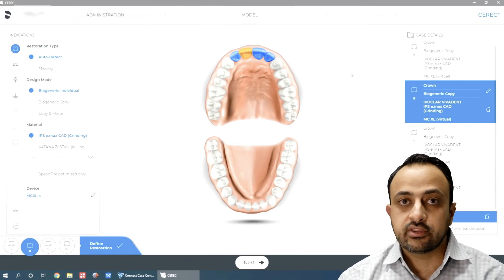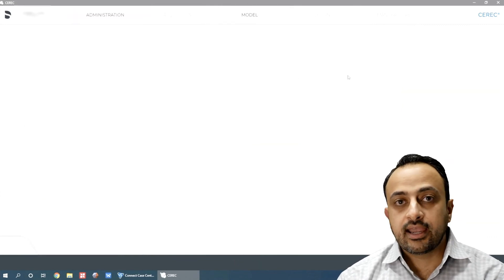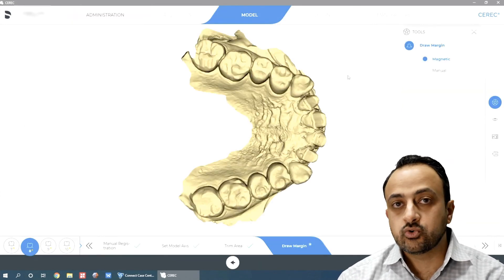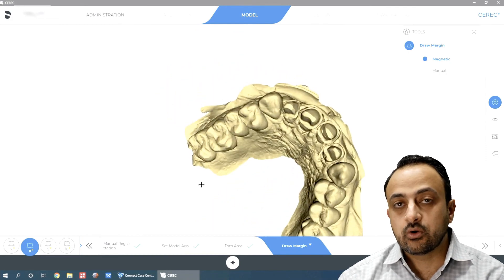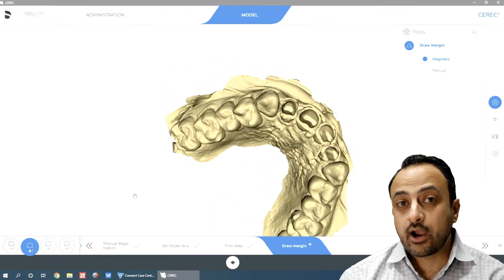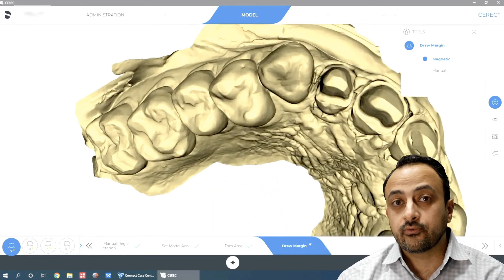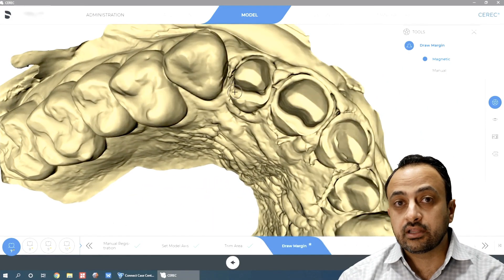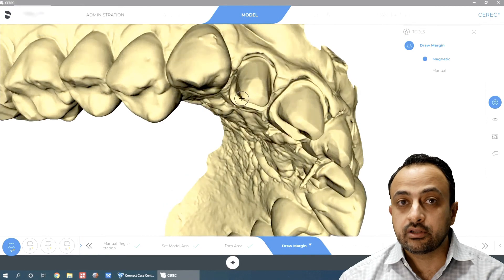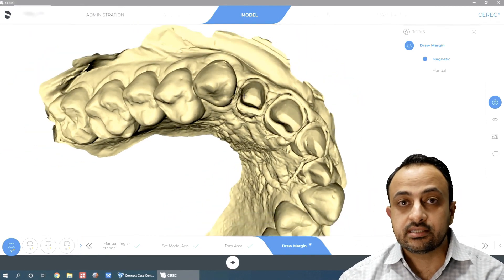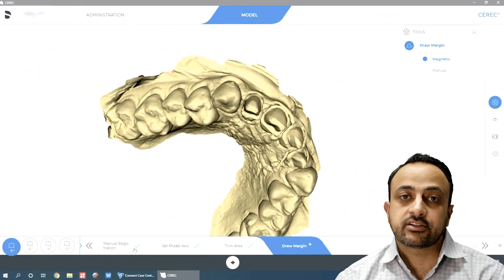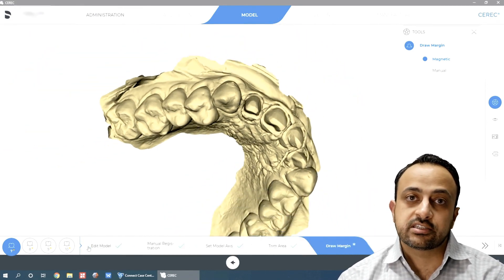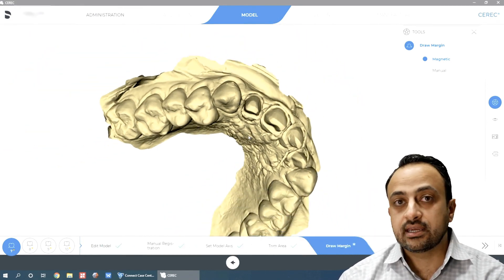Once I get everything designed, I can proceed as usual, send it to my milling machine and finish the case. So again, one of the most powerful features of the InLab software is the ability to import STL files and then send them back to your Chairside software as a DXD.